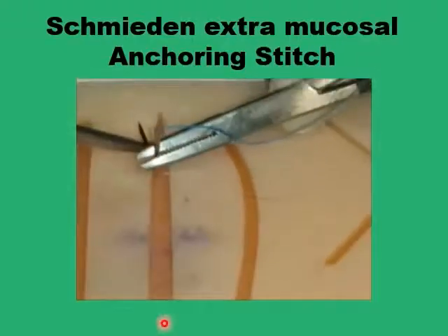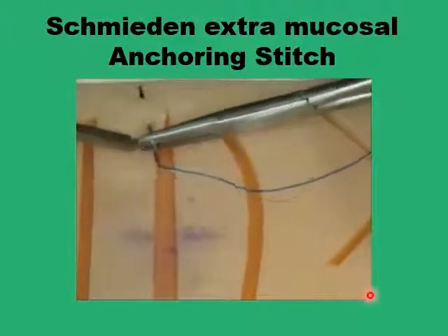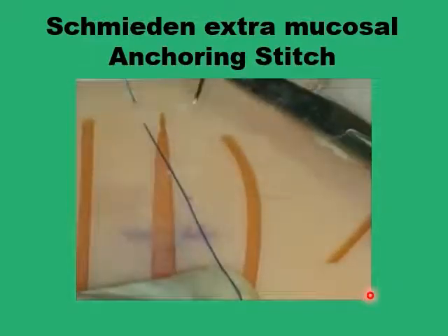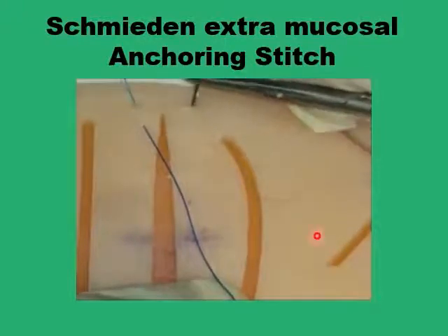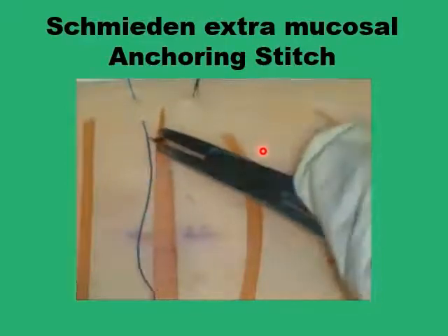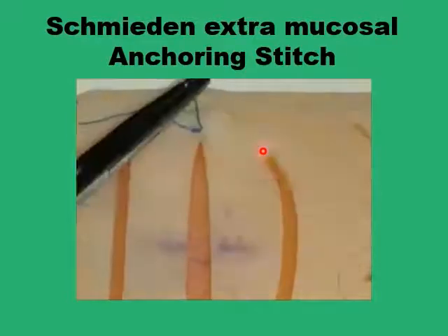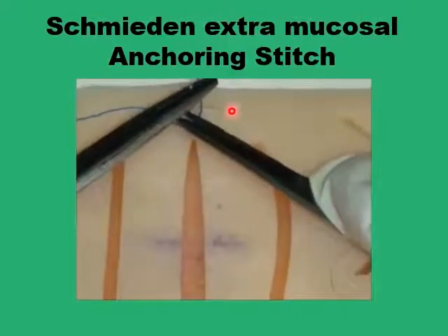We are starting the anchoring stitch for the Schmidden by doing the reversed horizontal mattress suture, going from below the apex to beyond the apex and then returning back. You can then tie your first knot, leaving a conventional reversed horizontal mattress suture with a loop above the apex.